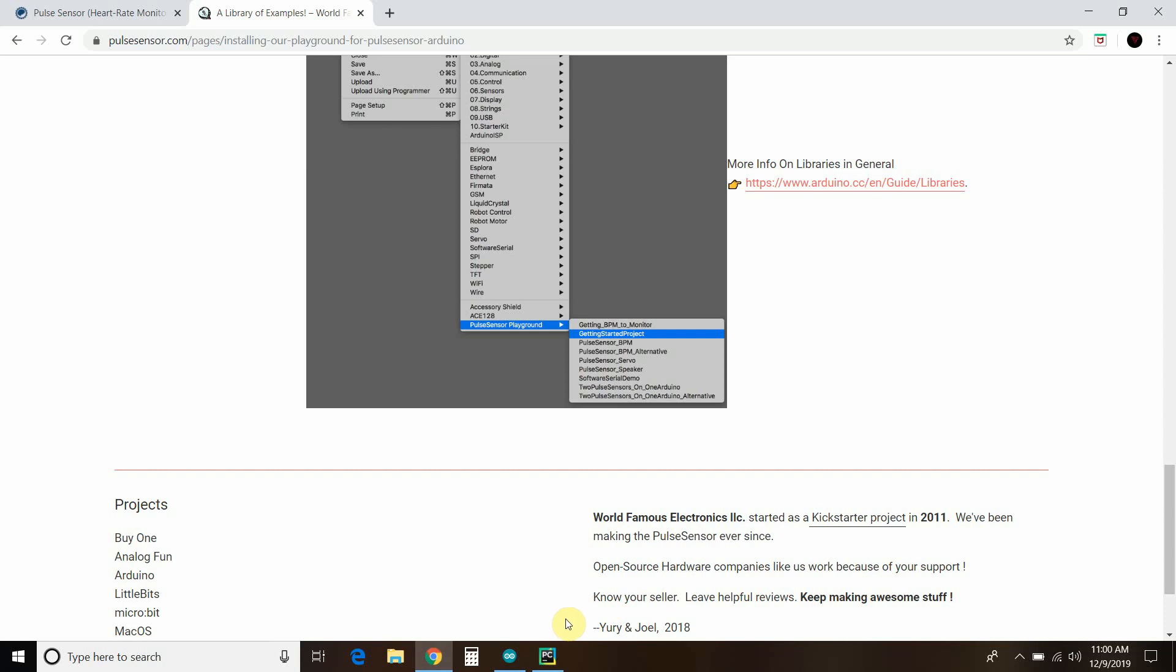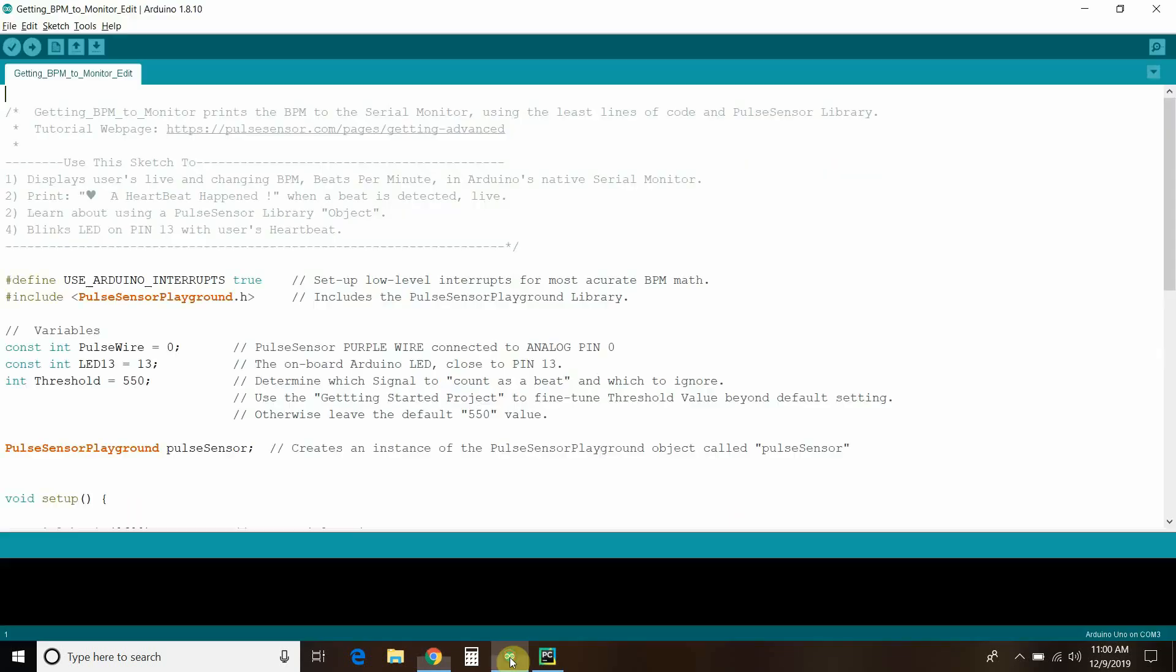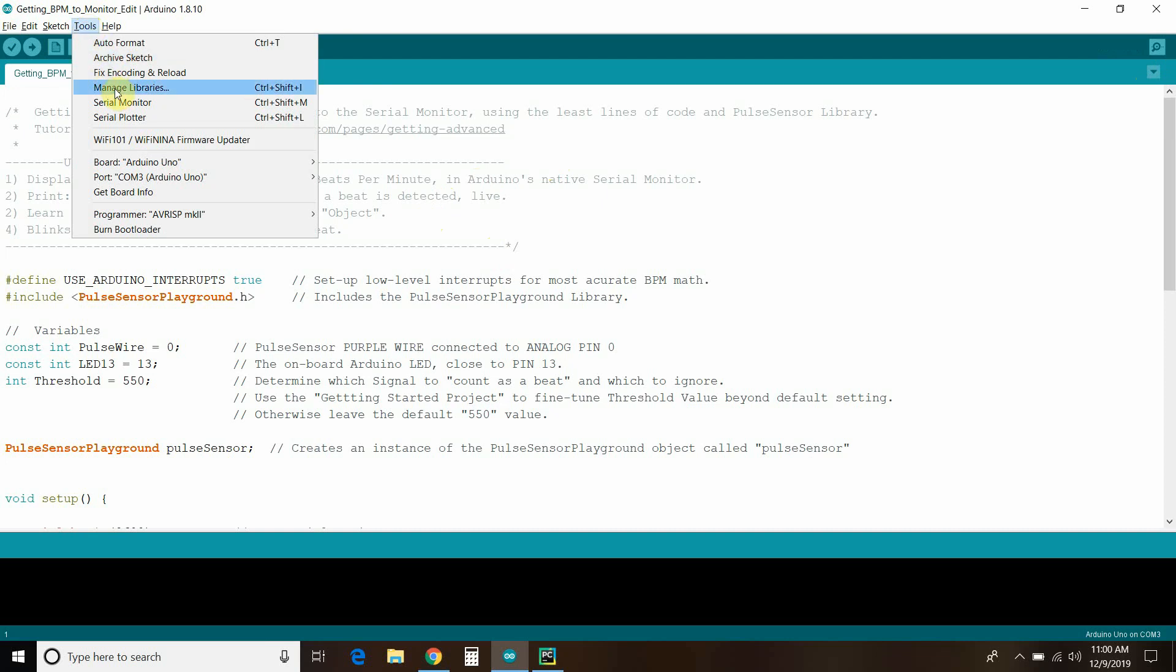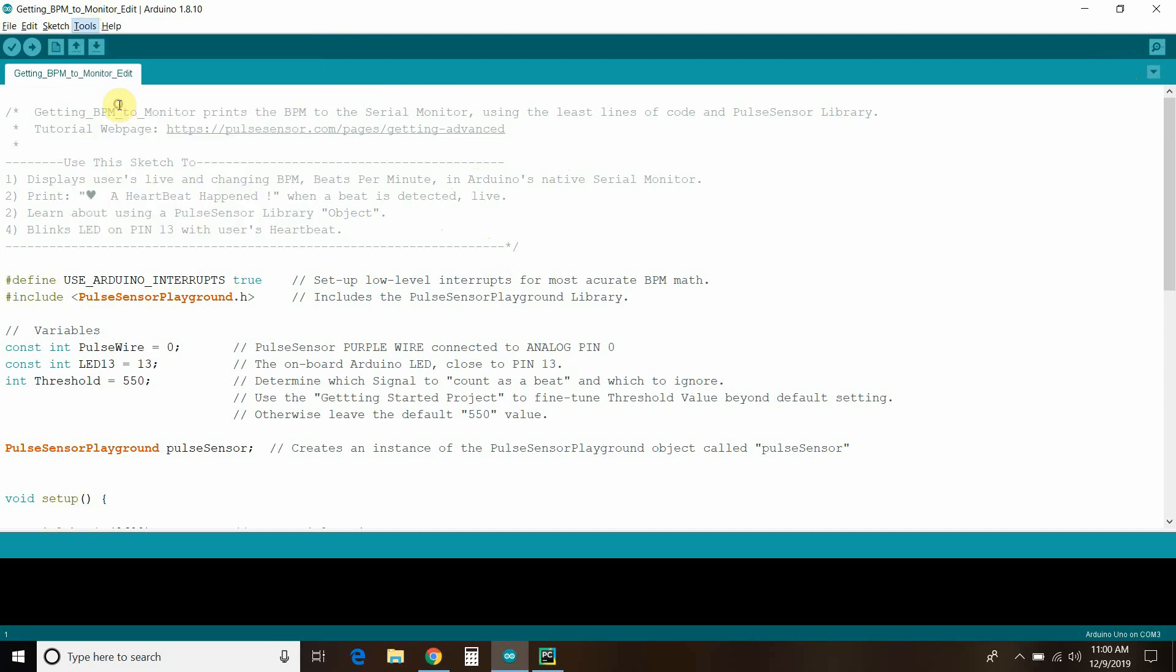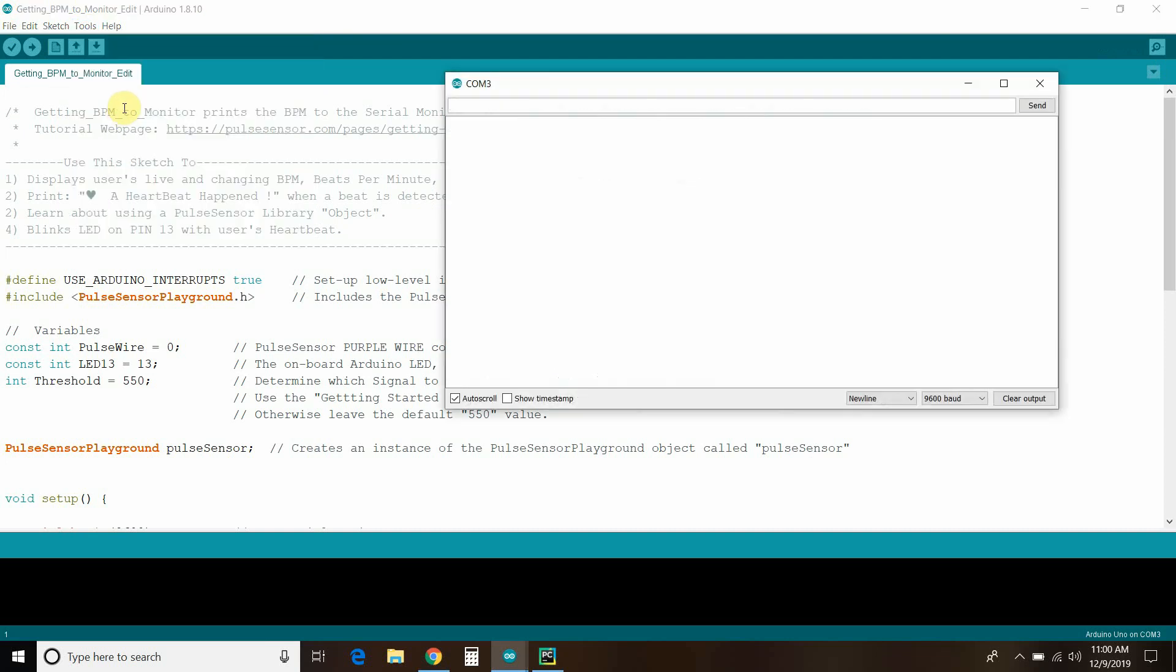So, in Arduino, here we go. I'm going to connect the pulse sensor to my finger. All right. So, we're going to open the serial monitor. You could do that by going to tools, serial monitor. Okay. It says we created a pulse sensor object, and now it is measuring my beats per minute.